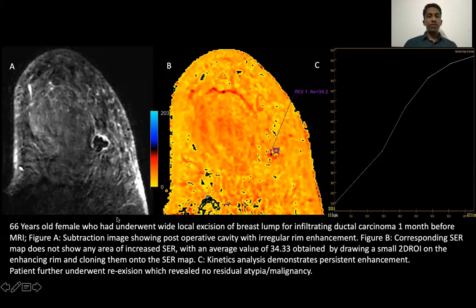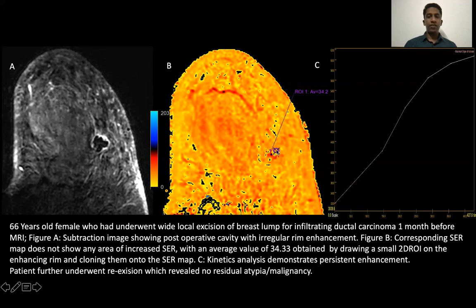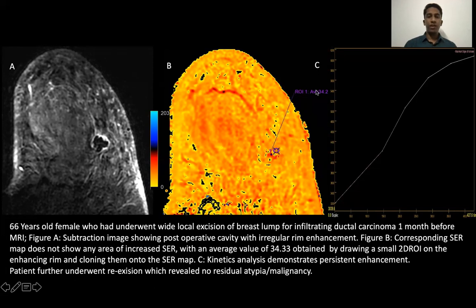Case 3: A 66-year-old female who had undergone wide local excision for infiltrating ductal carcinoma. The subtraction image shows a postoperative cavity with irregular thick rim enhancement. The corresponding SER map does not show any areas of increased SER, and the absolute value obtained by drawing a 2D ROI on the thick irregular rim enhancement and cloning it onto the SER map reveals a low absolute value of 34. The corresponding kinetic analysis revealed persistent enhancement. The patient underwent re-excision, which revealed no residual breast carcinoma.